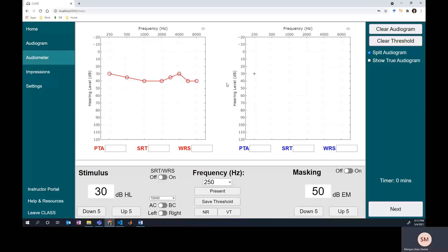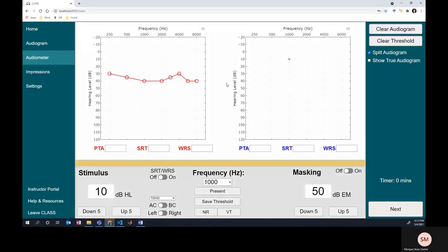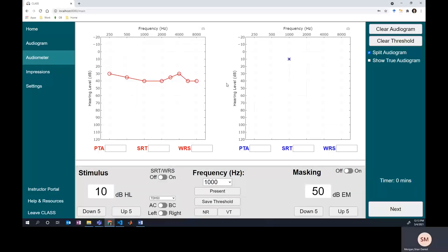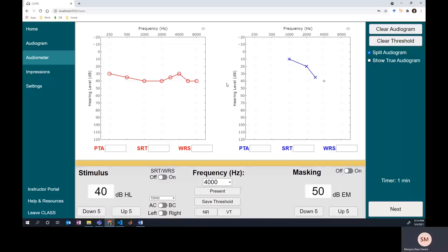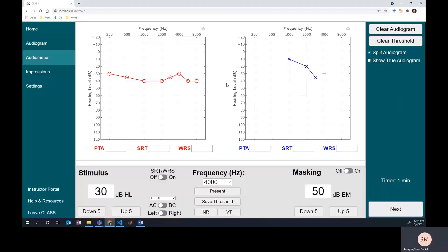There's my kind of odd looking right ear. Let's see what's going on on the left. I'm testing adjacent frequencies — I usually just go up by a little bit to see if it'll be audible. In this case it didn't work because it looks like there's some sloping loss here. I usually just go up by a little bit so I don't start at 50 every single time. It's just a little way to save time when you're checking all your thresholds.